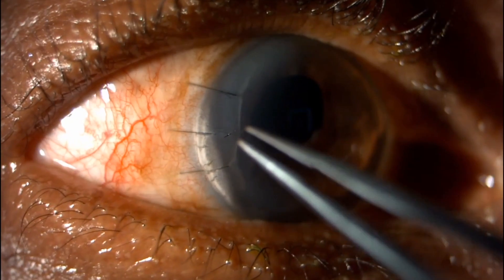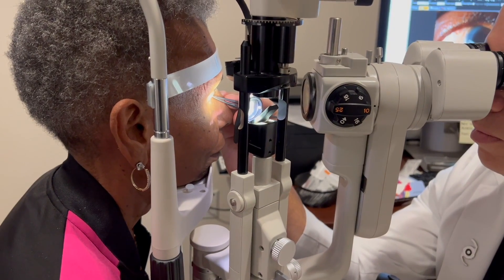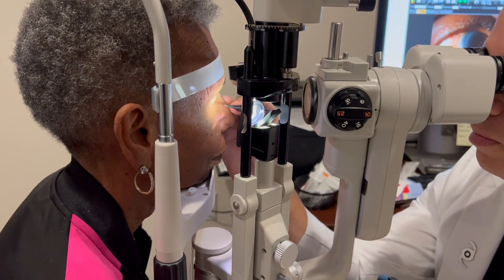The third important step is to grab the suture and quickly pull it out of the cornea. You don't want to pull slowly — if you pull slowly it'll begin to move the eye and patients can feel that and they get very nervous and uncomfortable. Quickly grab the suture and pull it out real quick, like taking a band-aid off. Here's that technique on our patient: we're using our tying forcep to grab onto the end of the suture, and we're going to quickly flick that suture out.